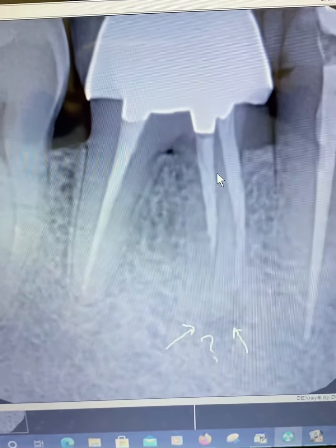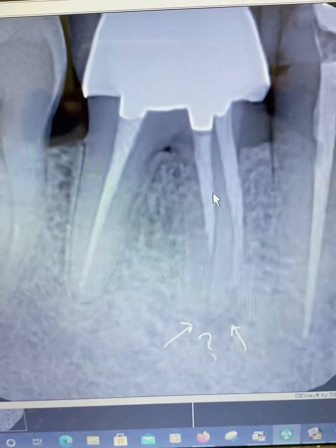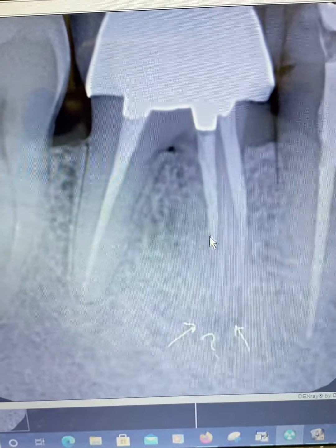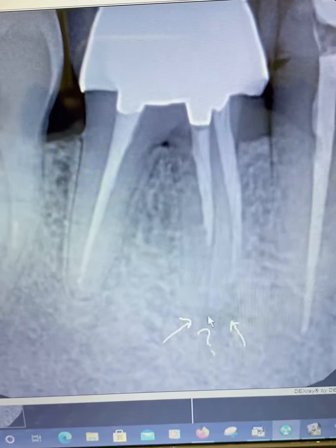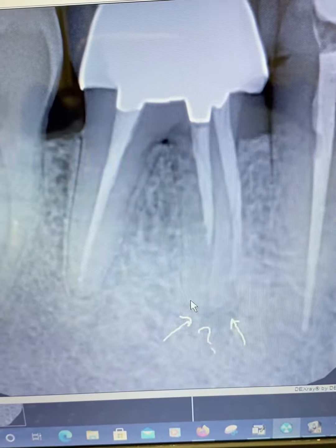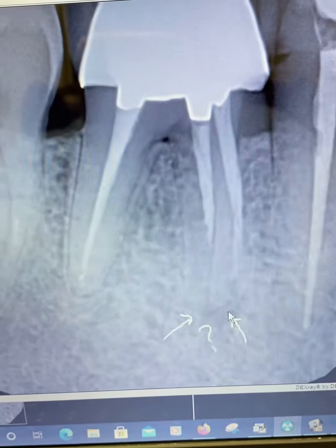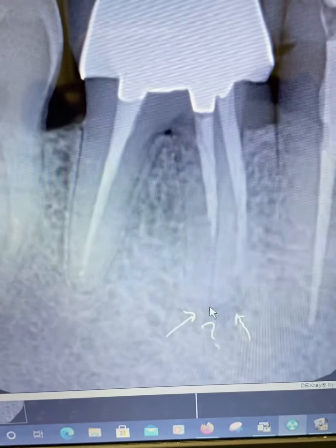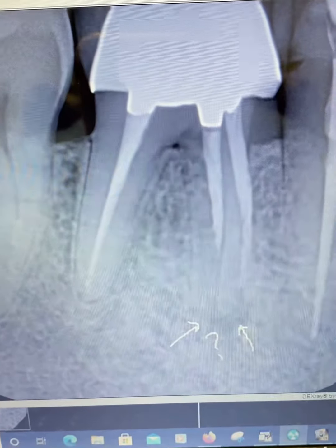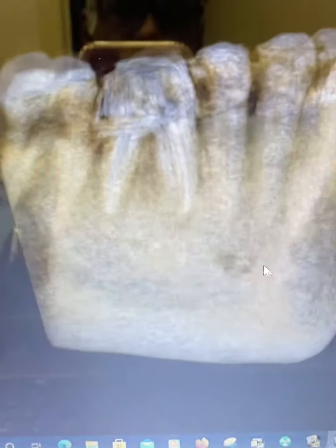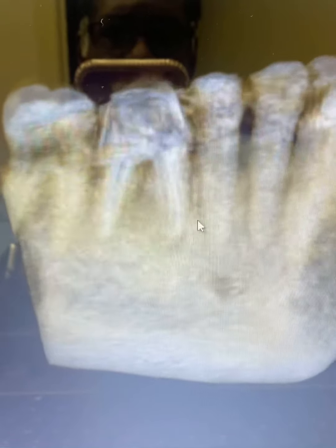You can see that whenever they did the original root canal, they could not get all the way down to the apex. It looked like there could be some pathology here, but it was kind of unclear. So we decided to do a limited field of view 3D CBCT on this case.